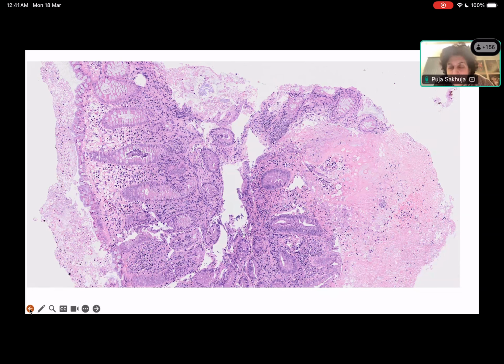Okay, but suppose this was some villus atrophy then. What are the types of cells you get in the small intestine? Paneth cells will be present in the small intestine and in what part of the colon? Ascending. Cecum, ascending colon, right up to the middle of the transverse colon. Okay, Paneth cells are present throughout that region. Of course, they increase when you go down from the duodenum towards the ileum and in the cecum also. And then again, they start decreasing a little bit till the upper parts of the ascending colon, hepatic flexure, and transverse colon. But you can see them there. So one is the presence of Paneth cells. So are you seeing any Paneth cells in this? No. So this biopsy is likely to be from the left colon, correct?